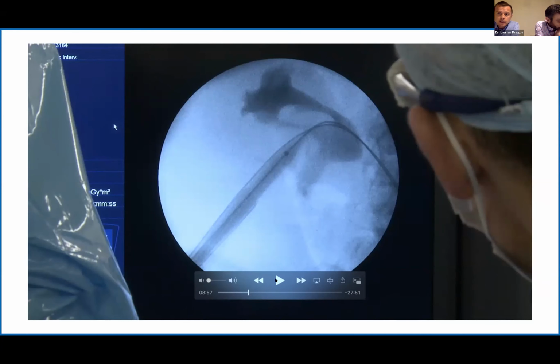Honestly, I don't know exactly the numbers from the manufacturer, so maybe Uli can help us with this. But I remember from a previous discussion that I had with Uli, when we were discussing these settings, this machine should be around 200 microseconds for short pulse and around 800 microseconds for long pulse. But don't take it as very exact numbers. This is what I think. Maybe the manufacturers can let us know more. Exactly. My colleague Graham will answer the question via the chat. Okay, that's perfect. Thanks.